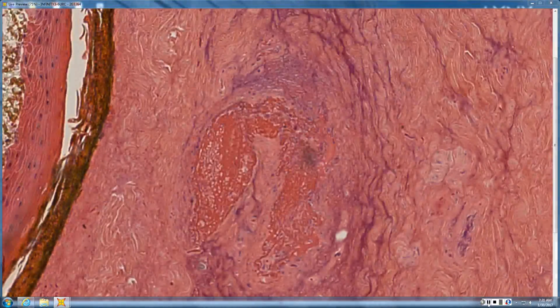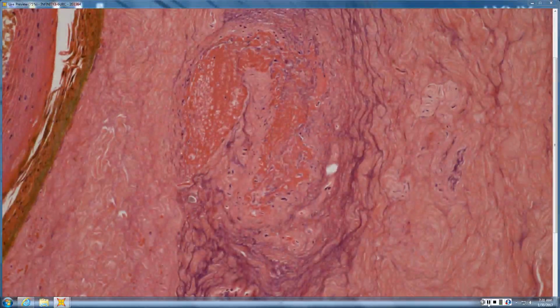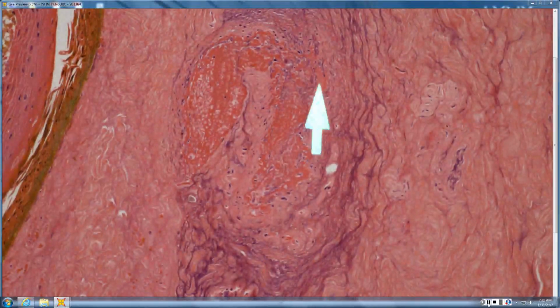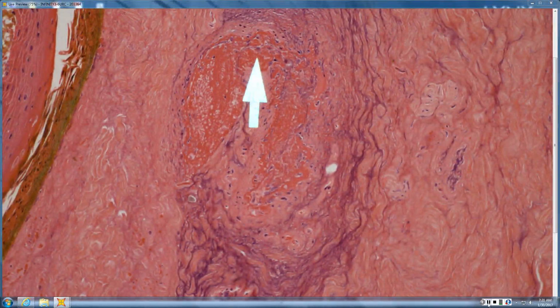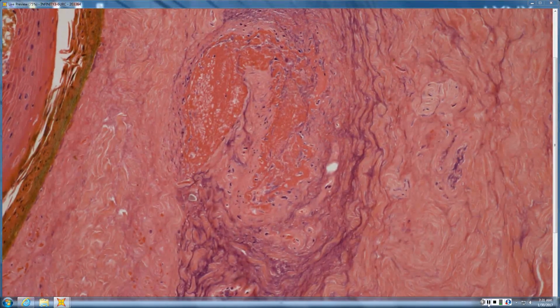Sure. So, very large piece of tissue. Looks like some necrosis there. Yeah, so that's a vessel. Not too happy a vessel. Not very much inflammation. There's kind of a bluish tint maybe around it. So what would give you a dead vessel with not much inflammation but a blue haze around it? Like an ecthyma gangrenosum, exactly. Very good.